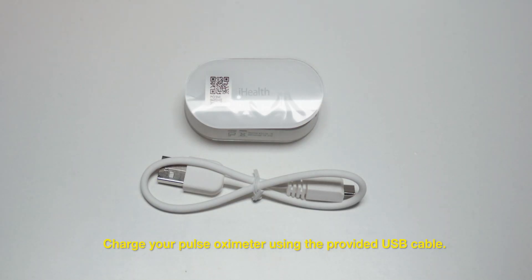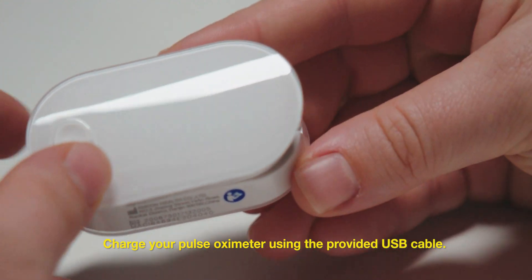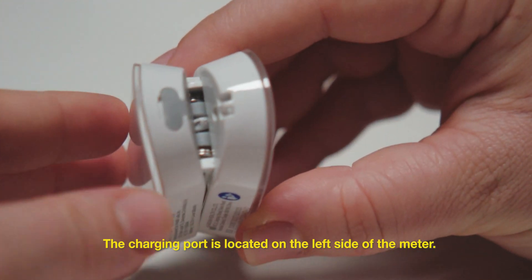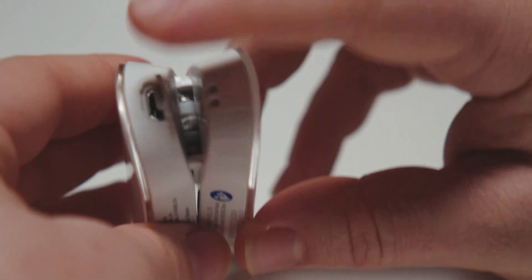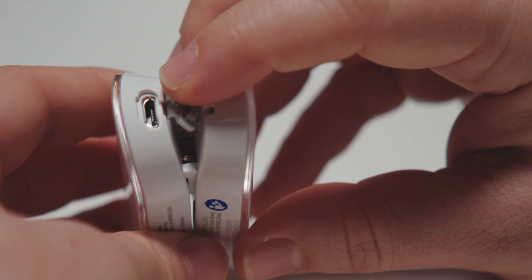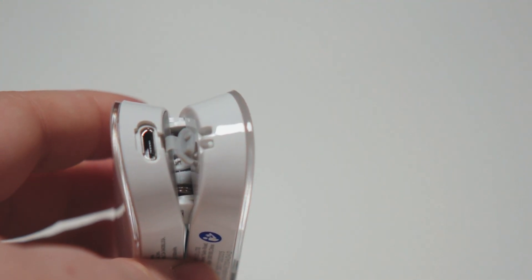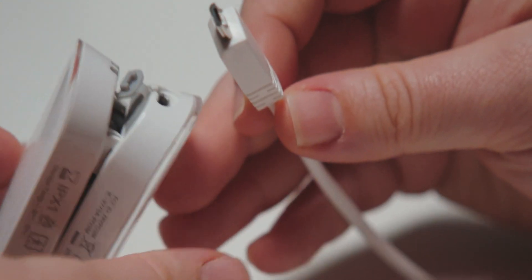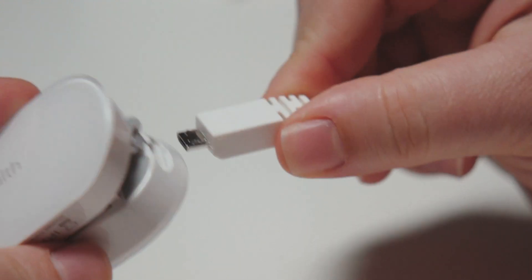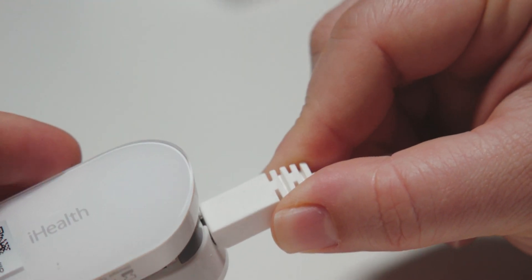Charge your pulse oximeter using the provided USB cable. The charging port is located on the left side of the meter.